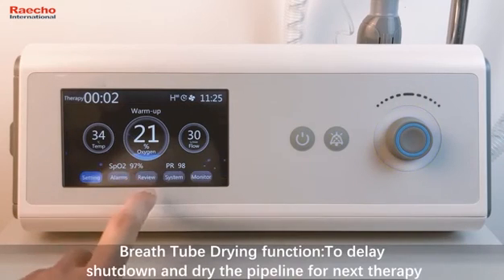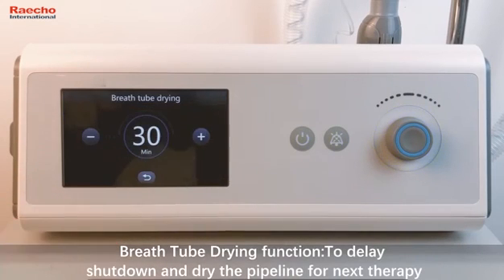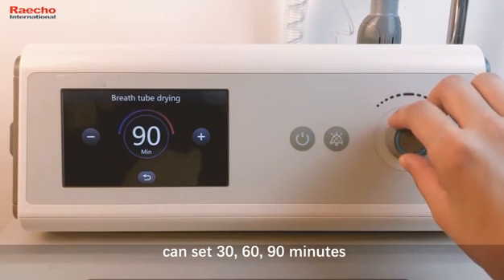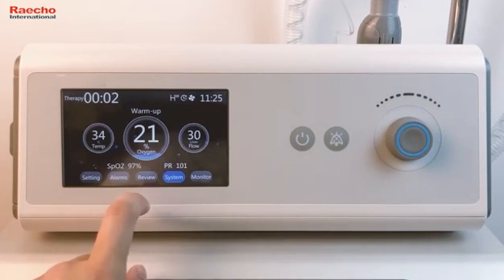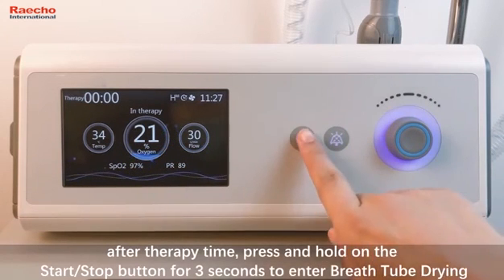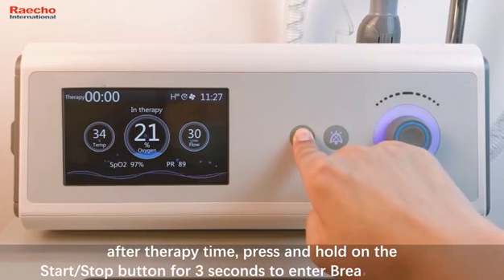Breath tube drying function to delay shutdown and dry the pipeline for next therapy. Can set 30, 60, 90 minutes. After therapy time, press and hold on the Start Stop button for 3 seconds to enter breath tube drying.